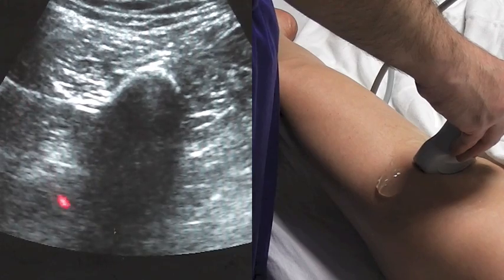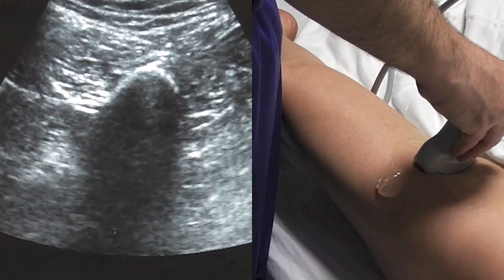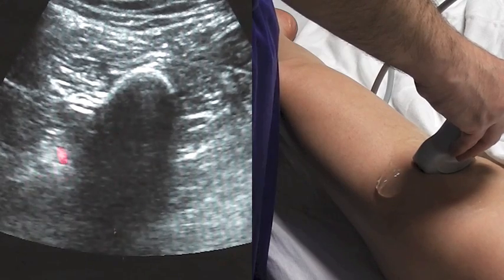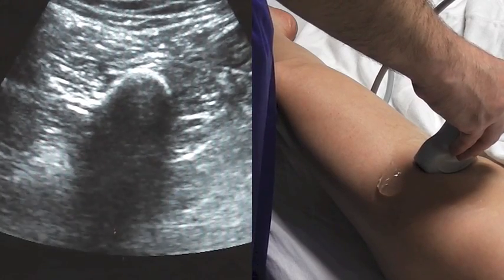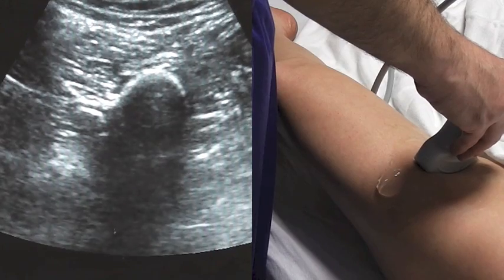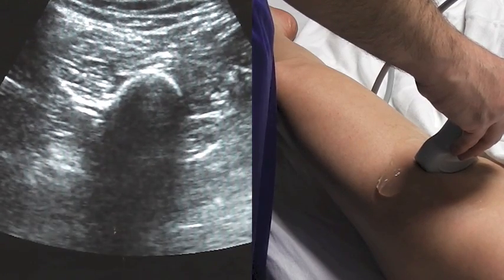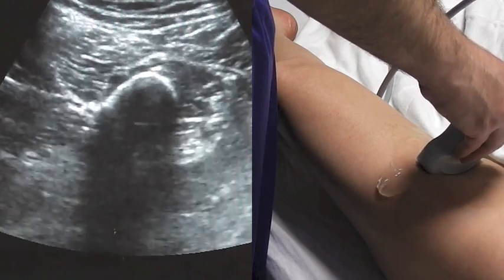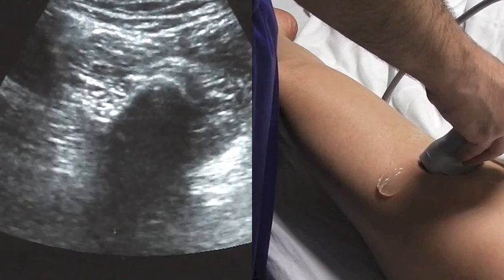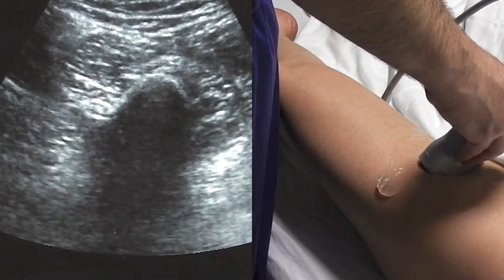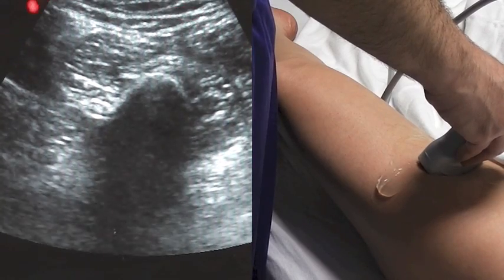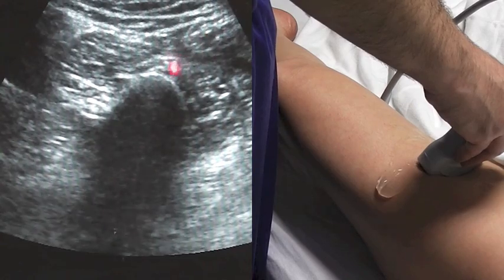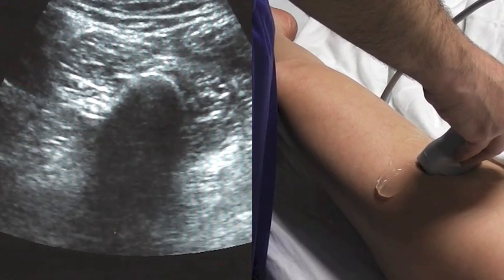After confirming that I have the proper nerve by nerve stimulation, I will inject local anesthetic around the nerve. For this nerve block, we use 30 cc's of local anesthetic — usually 0.5% ropivacaine, however on occasion we will use 0.25% marcaine. The structures to avoid, obviously, are the femoral vessels, which is why it's one of the two structures I want to identify before placing my needle.